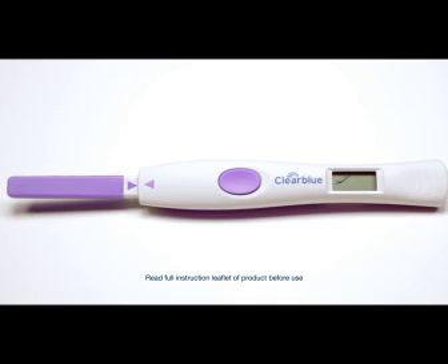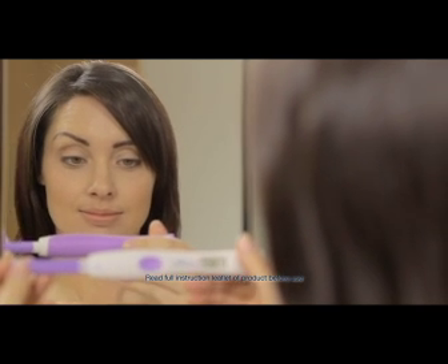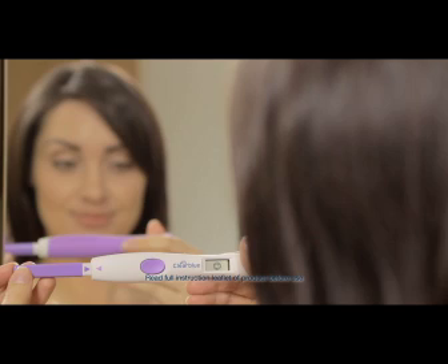Replace the cap and lay the test flat or keep the absorbent sampler pointing downwards. Never hold the test with the absorbent sampler pointing upwards. Within one minute, the test ready symbol will flash to show the test is working. After five minutes, read your unmistakably clear digital result.